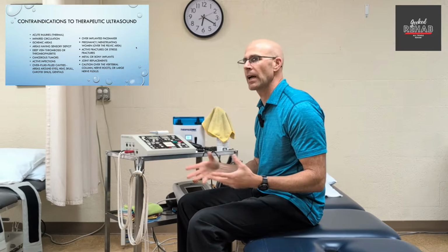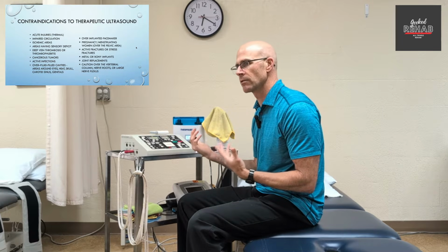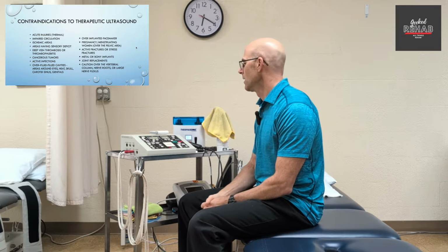And they should also verify that you don't have any implants or different devices that could be counterproductive to using an ultrasound. Oftentimes I'll use ultrasound for a couple of different reasons. One, to decrease inflammation. Two, to create deep heat.